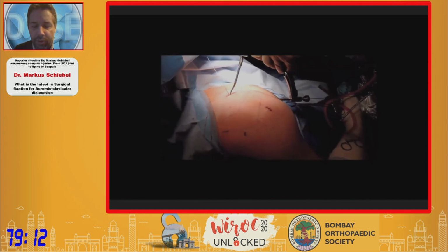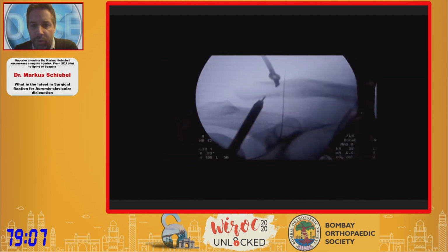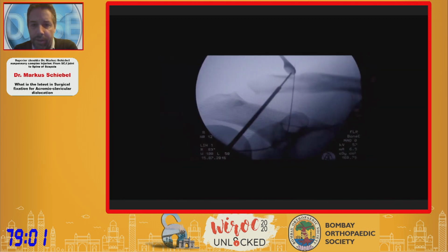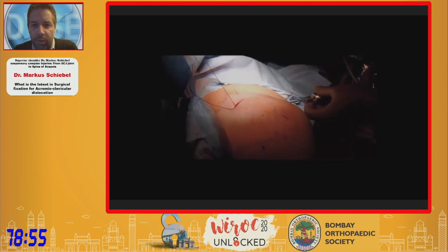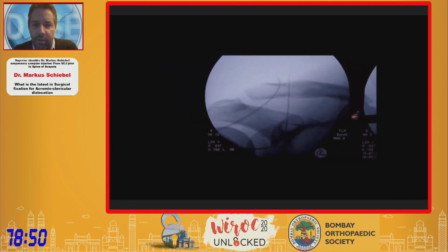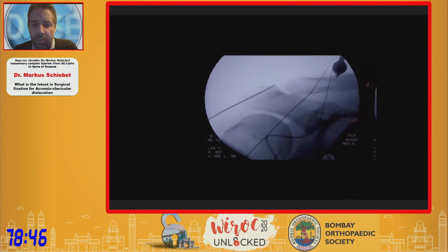So we switch our drill, our guiding device over the clavicle, and we come via the anterior-inferior portal percutaneously. We place a 1.25 millimeter K-wire, and this K-wire is over drilled with a 2.7 millimeter drill. We insert a nitinol wire, so now we have the AP drill for the AC cerclage in the clavicle, and we do the same now via the acromion.